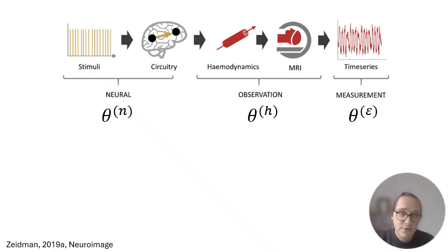So this is a figure from Peter's Introduction to DCM paper. I cannot recommend this paper and its partner paper, which looks at the second level group analyses, highly enough. It's an excellent place to start if you want to do some DCM analyses. And what this is showing is an overview of this forward DCM model, which we're specifying.